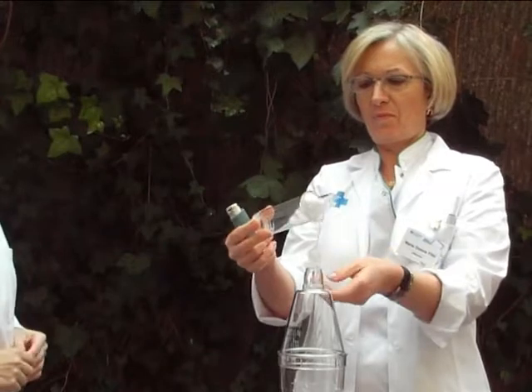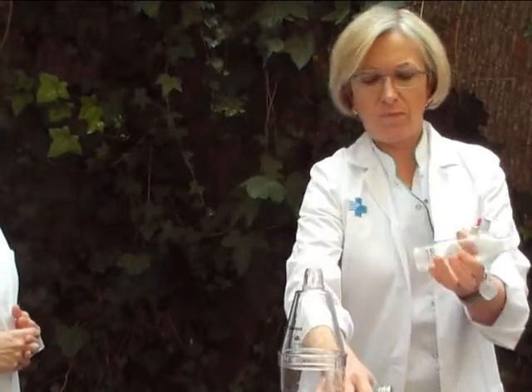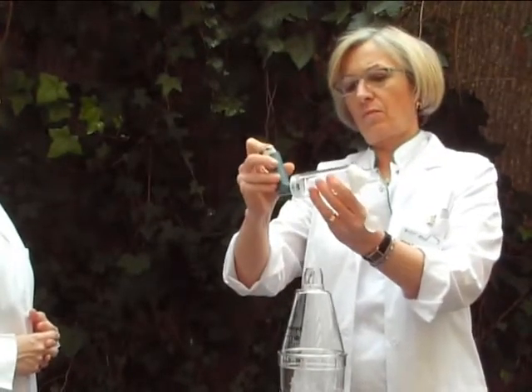Firstly, we must remove the cap of the ProCember as well as the cap of the Inhaler. Then we have to shake the Inhaler firmly and insert it into the ProCember.